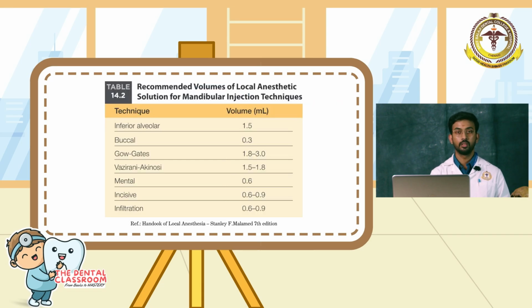Hope you have understood. So, just a summary clip about the recommended volumes of local anesthetic solution for mandibular injection techniques. For inferior alveolar nerve block technique, recommended volume is about 1.5 ml. For long buccal nerve block, recommended volume of injection is 0.3 ml. For Gow-Gates, it lies about 1.8 to 3 ml.